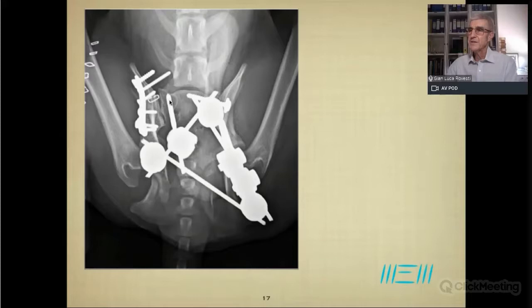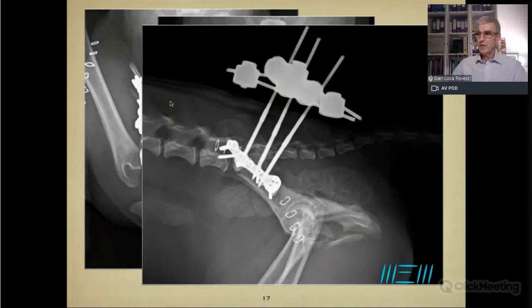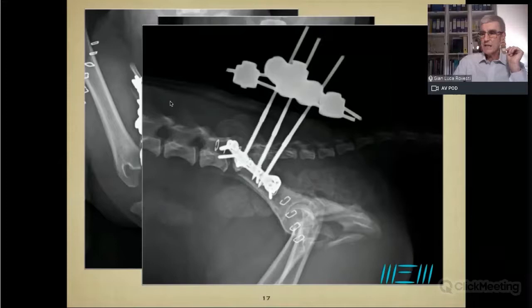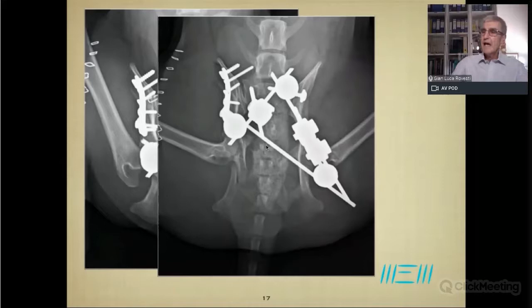So this is the sagittal projection, and this is the lateral projection, so you can better realize the distribution. It was just a cranial fixator. I thought that we didn't need to further stabilize here. Perhaps we may have put another threaded pin on the right ischium as well. Okay, this was our decision at that time. This is one of the very first cases.